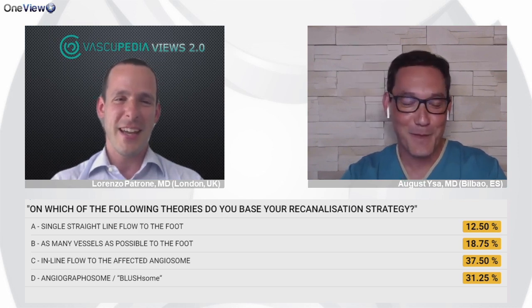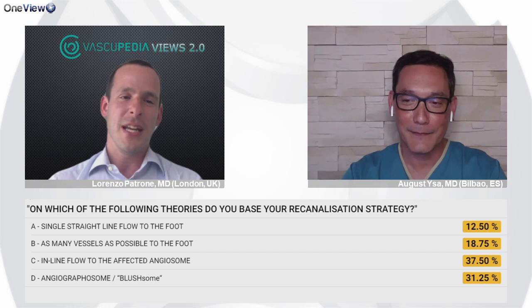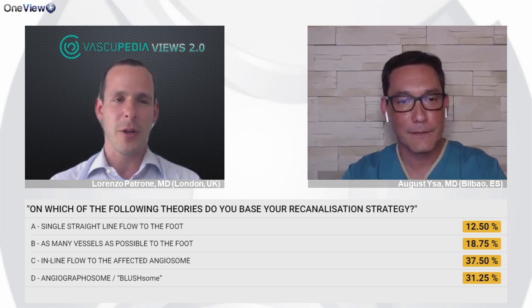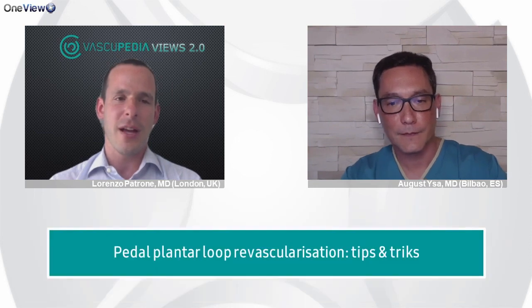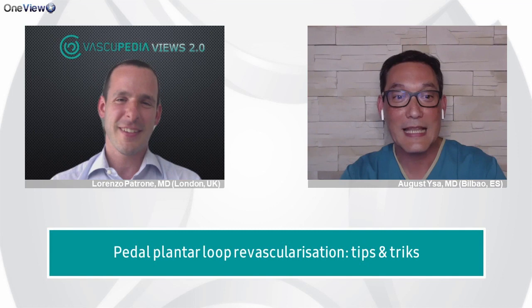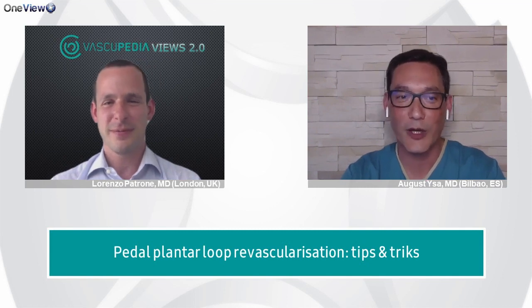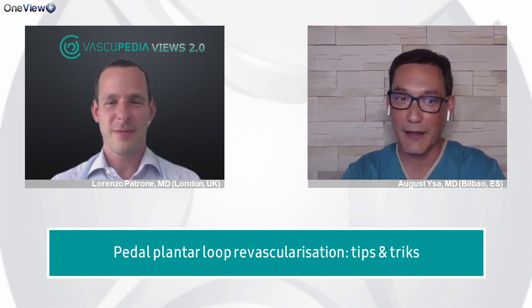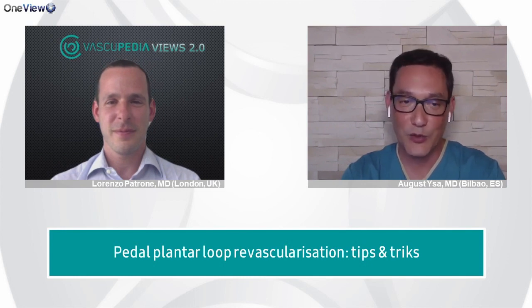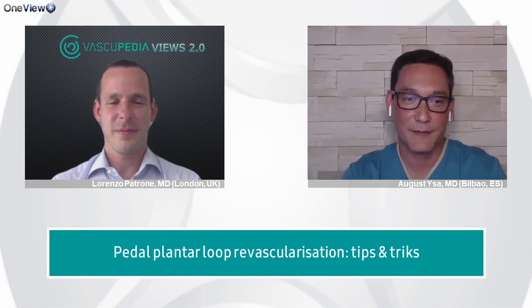Another thing I wanted to ask you, because it's something very important also for the juniors, for the people who follow us: do you always perform the anteroposterior view of the foot when you do a BTK recanalization? Yes or no? Definitely. That's essential to see what's going on. If you lose the vessel by the end of the procedure and you need to perform a rescue, if you don't perform your angios, the 2 projections beforehand, you will never know what has happened.